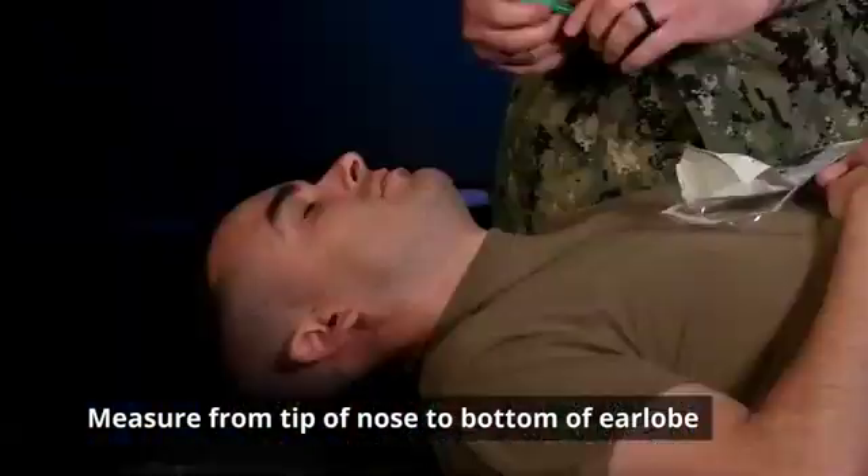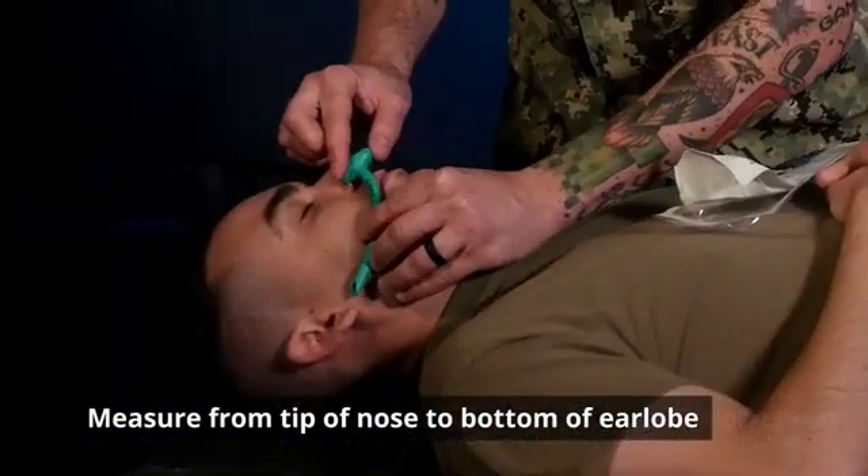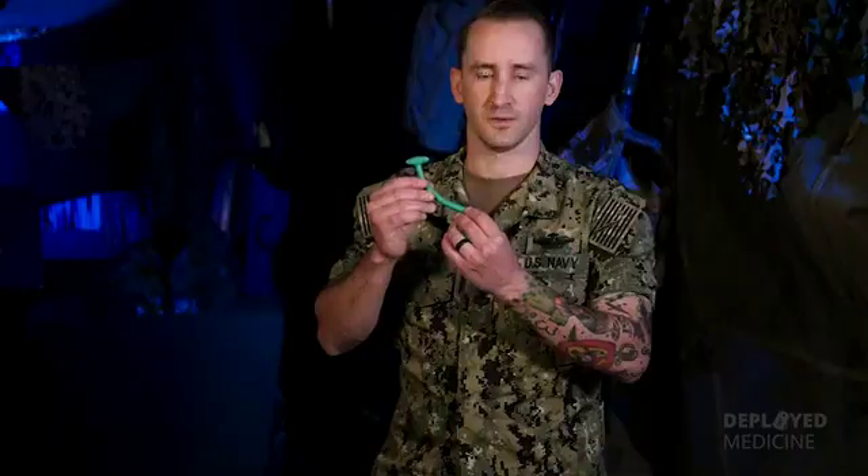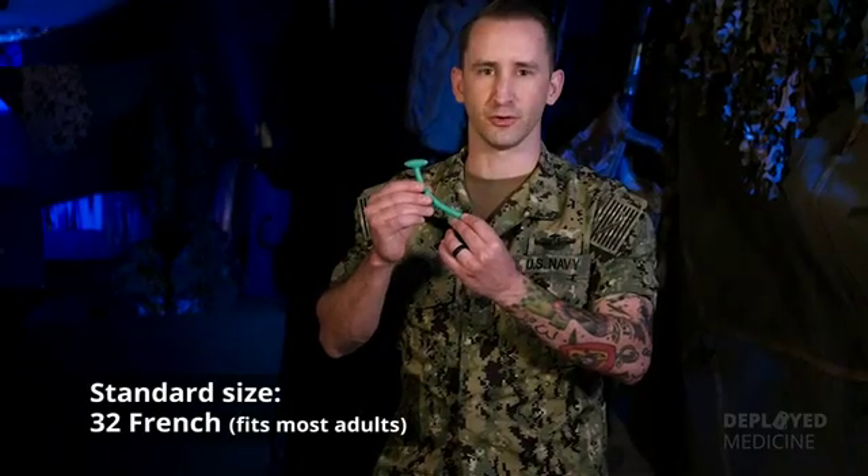The first step in inserting the NPA is to measure it and make sure it's going to fit your casualty. This is done by holding the flanged end to the patient's nose tip — the beveled end should meet the bottom of the patient's earlobe. The standard size NPA is 32 French.